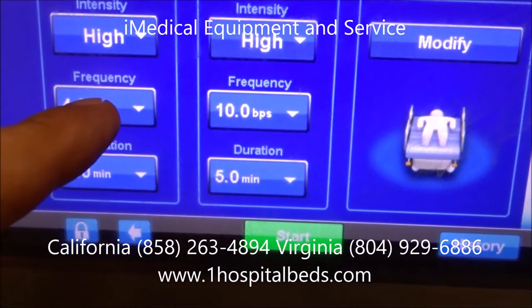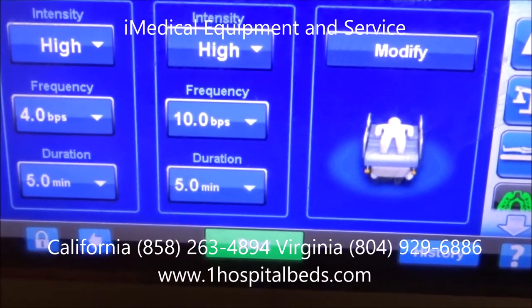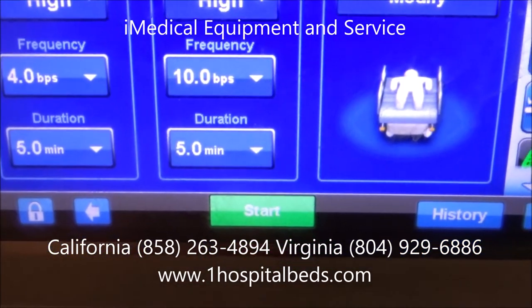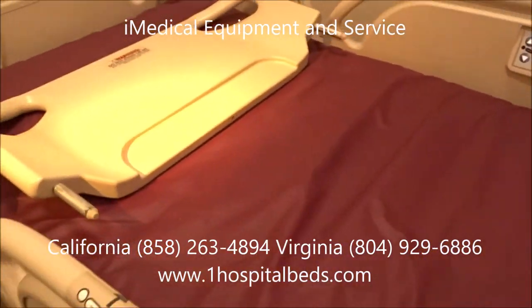You can also adjust the frequency in beats per minute using a slide bar, which makes it very user-friendly. You set the duration for how long you want it to run, and then it's as simple as hitting the start button. I'm going to go ahead and hit start.